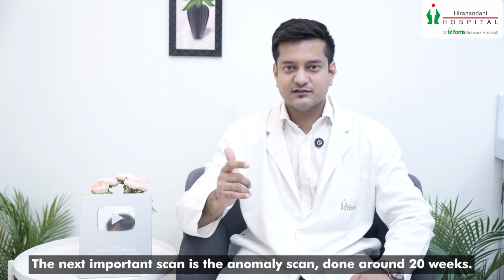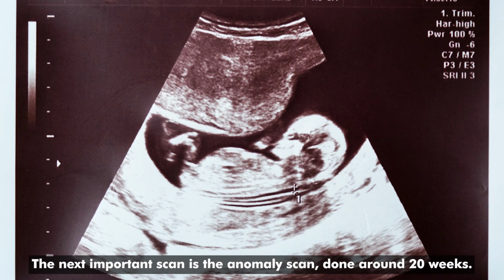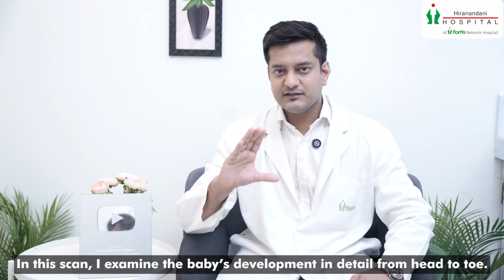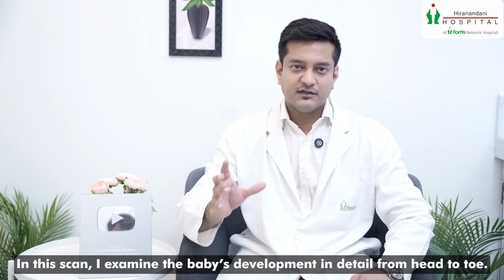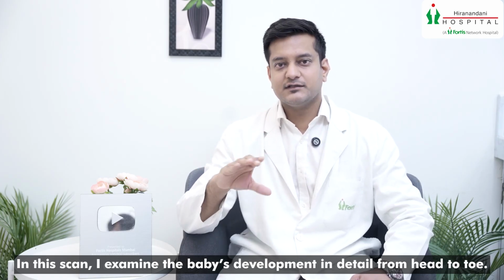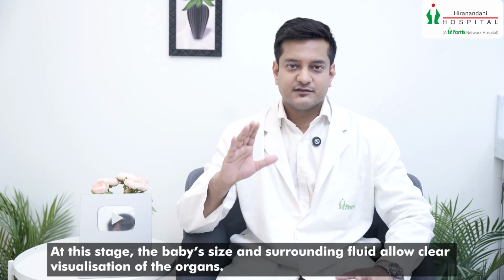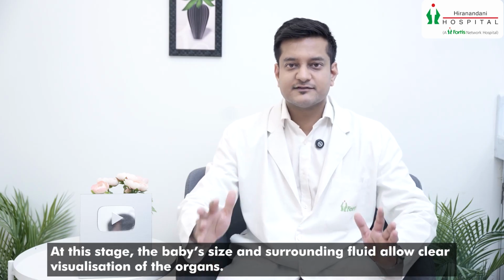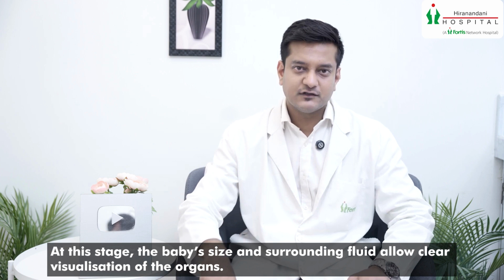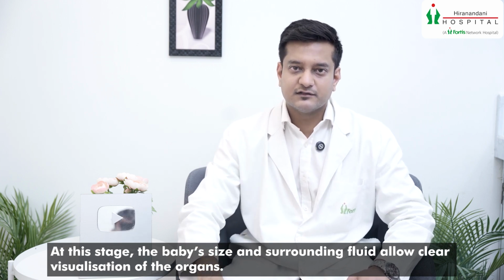Once the NT scan is done, the next scan is the anomaly scan, which is done around 20 weeks of the pregnancy. In the anomaly scan, we see in detail the development of the baby. The development of the fetus is seen from head to toe to the extent best possible. This is also the time when the size of the baby is appropriate and the fluid surrounding the baby is good enough to see the organs of the baby clearly.